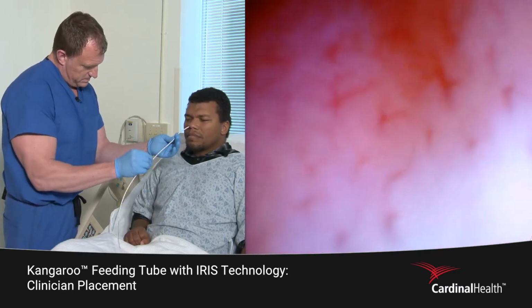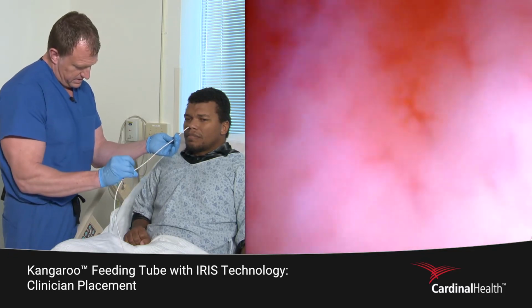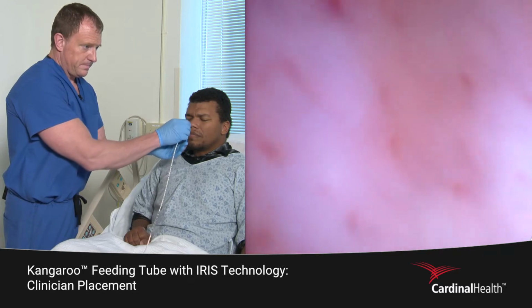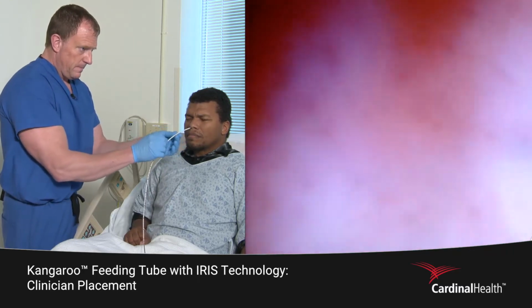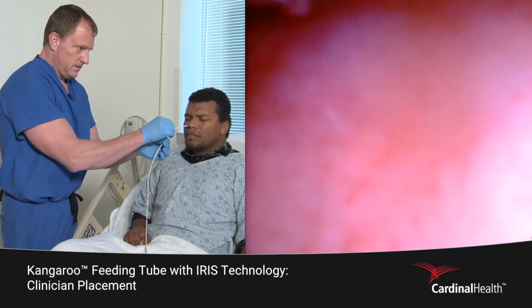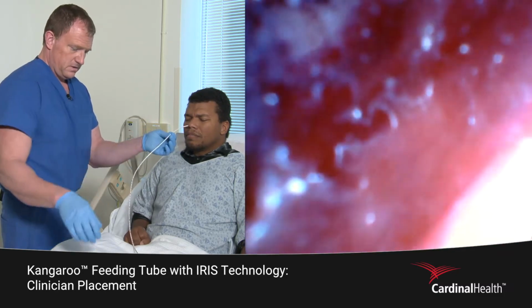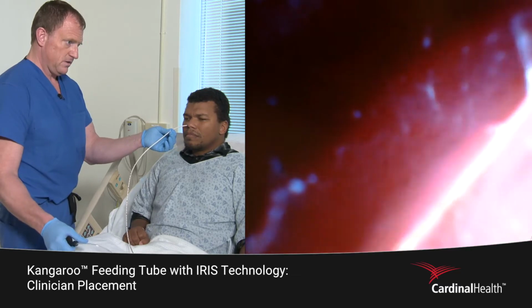Where I'm at on the tube, get the whole length of the tube here in front of me. Okay, so we have a little ways to go. Okay, I'm just gonna adjust some sort of cut on the side of your stomach a little bit. Okay, so there's a really good shot there of the upper part of your stomach and the folds.